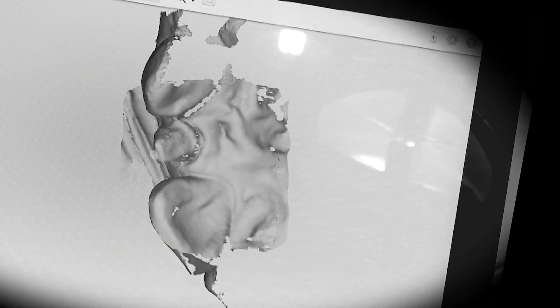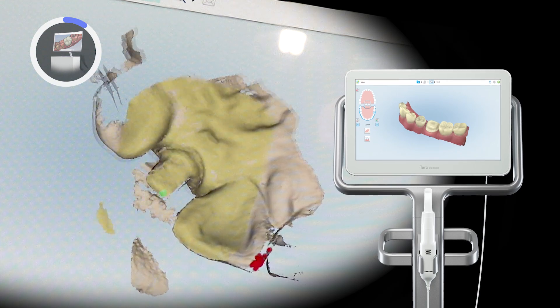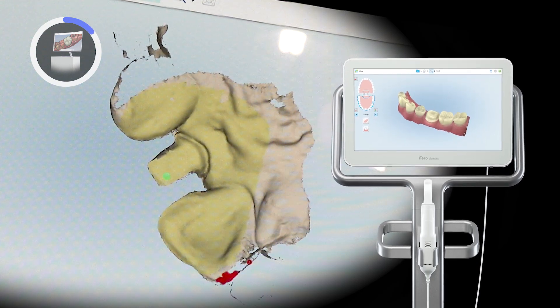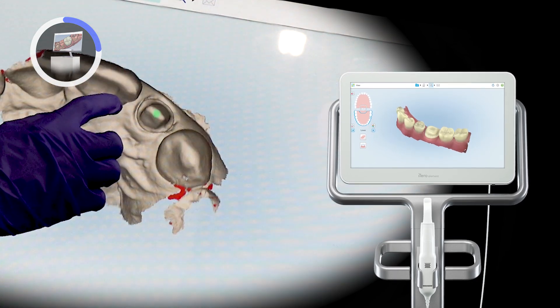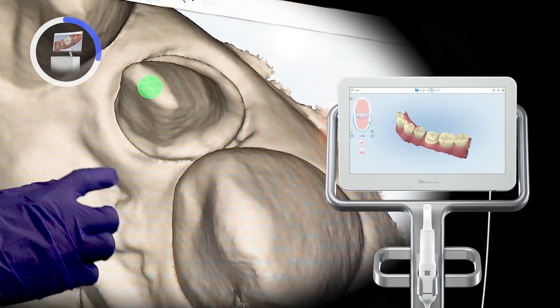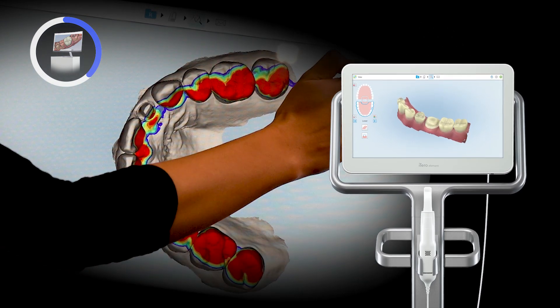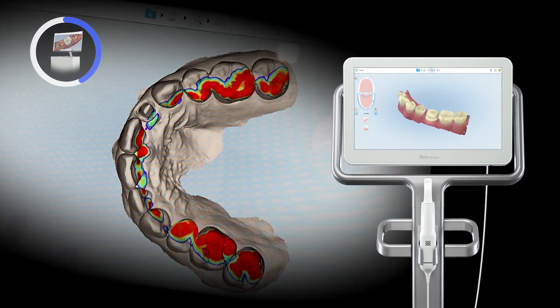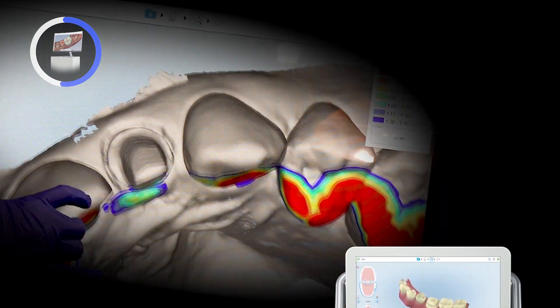In this situation, both cords were removed to get a more natural emergence profile during crown design. Once the scan of the prep, opposing, and biter is completed, I recheck the prep and occlusal clearance by checking the iTero occlusal gram. It's important to check your scan data acquisition before the information is sent over to the Glidewell I.O. and Office Fast Design software and design station.